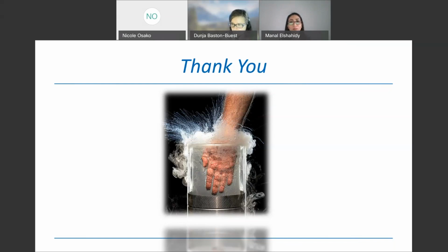There is a question: what about dry ice to transport sperm? I wouldn't do it that way. We always ship in the dry shipper, also the sperm and the slow frozen specimen. You will see that the outer surface just thaws.